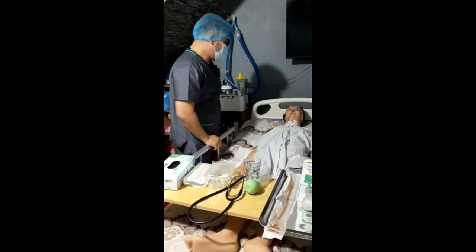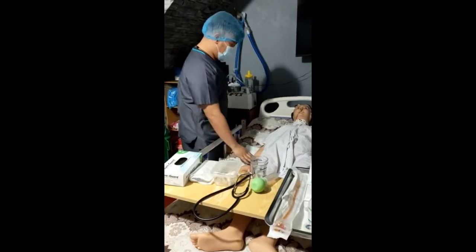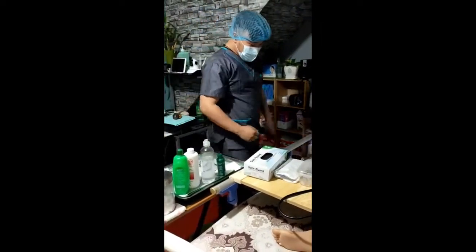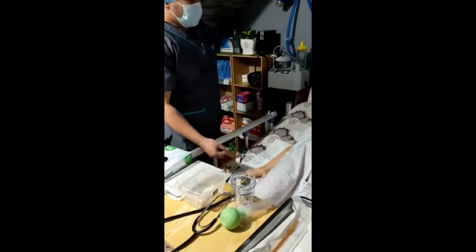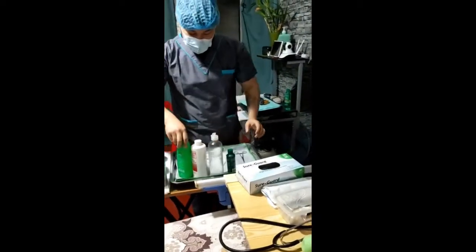Ngayon po si Neuron Laser. So maglilinis po tayo ng trach ngayon, ha. So next is, check muna natin yung pulse oximeter kung okay yung kanyang oxygen saturation. And then once okay, doon na tayo mag-proceed.